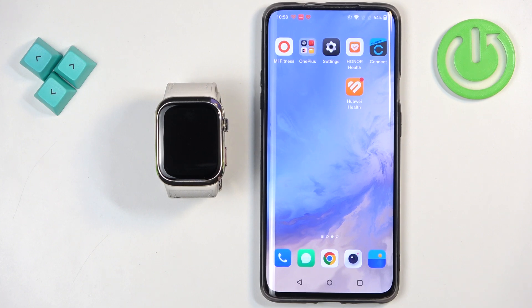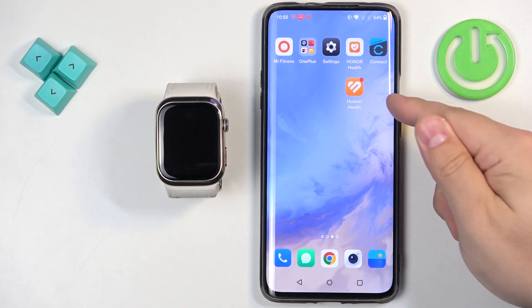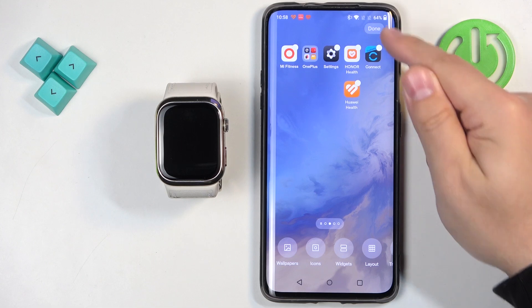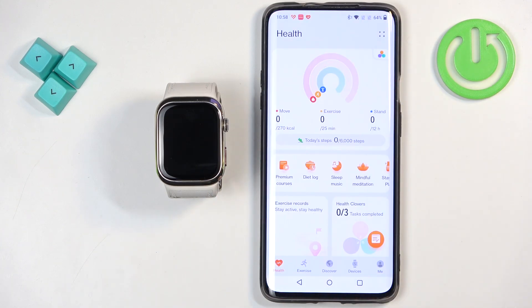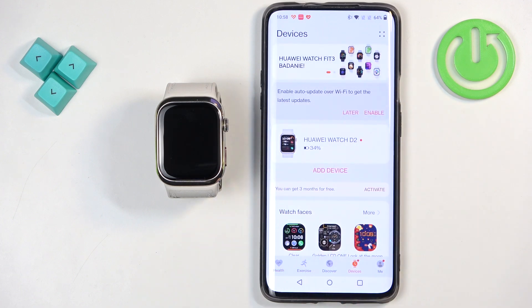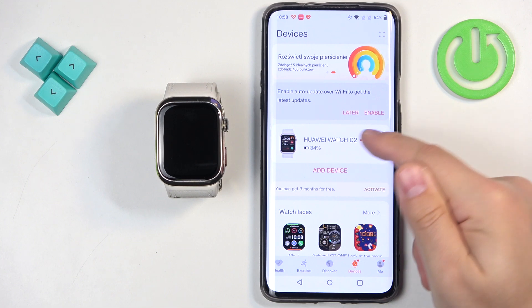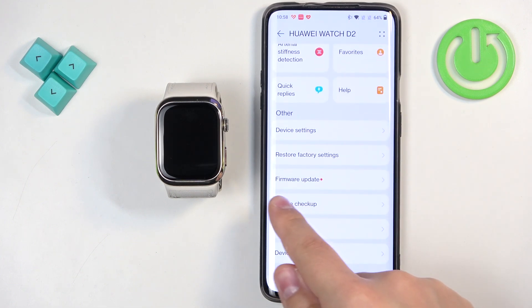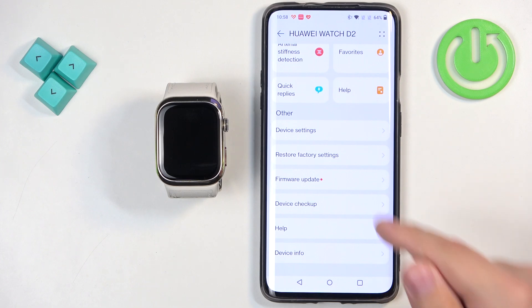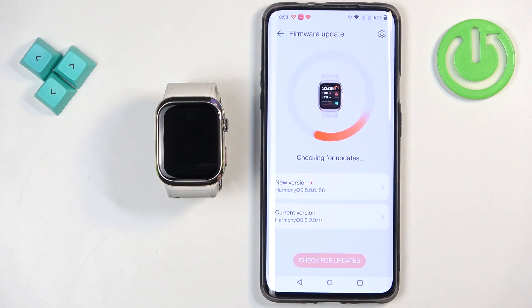Okay, let's continue with the update itself. To do it, we need to open the Huawei Health application on the phone that is paired with our watch. In the app, we need to tap on the devices icon. Here we have the Huawei Watch D2, so select it from the list of devices, then scroll down, find the option called Firmware Update, and once you find it, tap on it and wait.